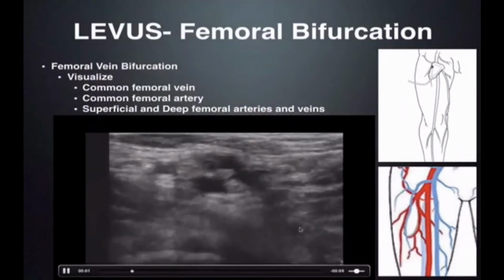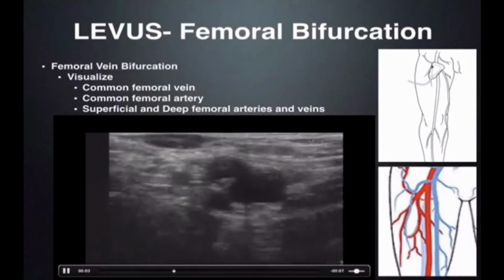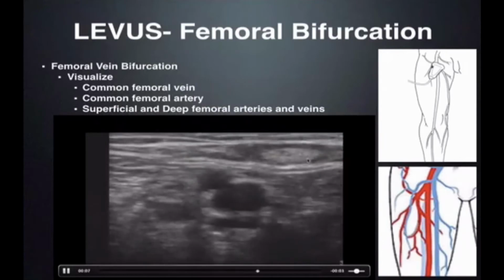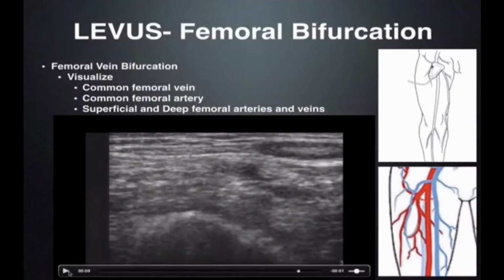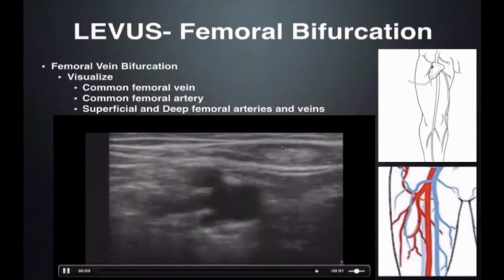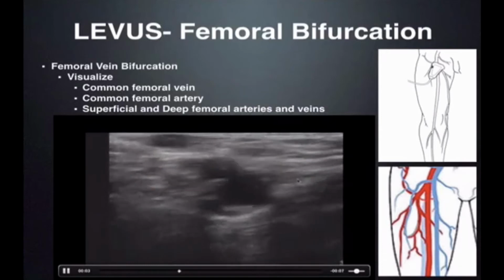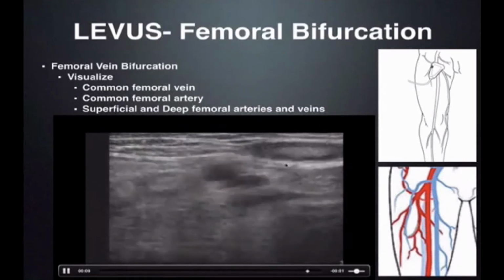Now as we go through this again, I want to bring your attention to something that pops up in the right upper viewpoint of the ultrasound. Right there. I'm going to freeze it. This is a very common pitfall, and physicians often mistake this for a DVT, but that's not a DVT, that is a lymph node. And the way you know that is if you look in 2 planes, you're never going to see the long axis view of the vein that you would expect to see. It's always going to look like a circular structure.